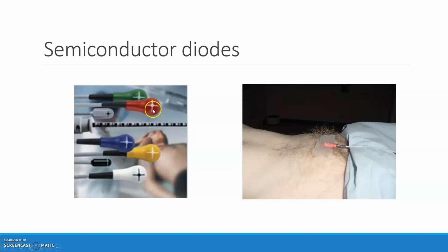They're colour-coded according to the energy range in which they should be used. So as far as I recall, green is the lower energy band, so you use those in the sort of 4 to 8 MV. I can't remember which one it is, but some of these other ones are used for higher energy ranges. And it's important, I'll explain why, that you use these in the correct energy range. You can't just choose a colour you like, you need to choose the one that corresponds to the energy of the beam that you're assessing.